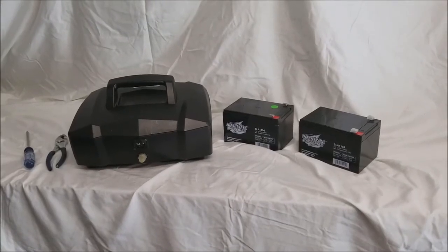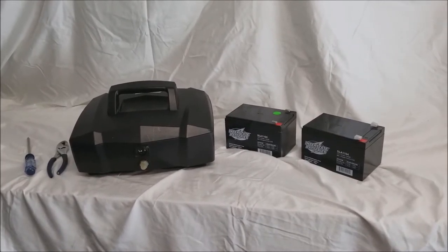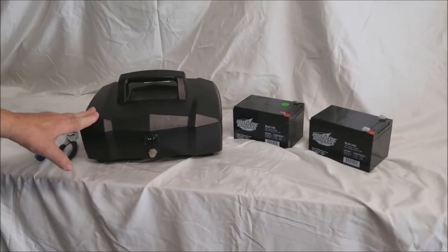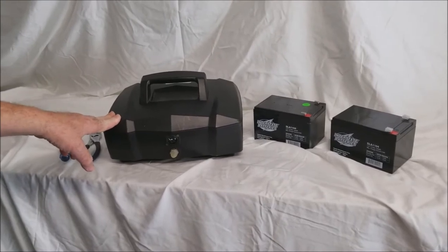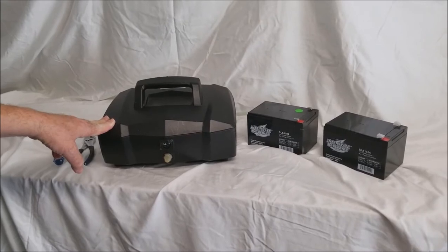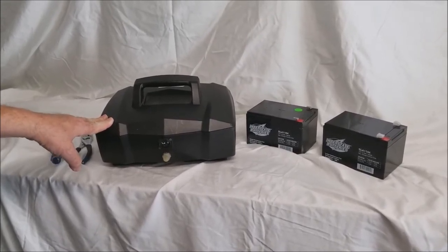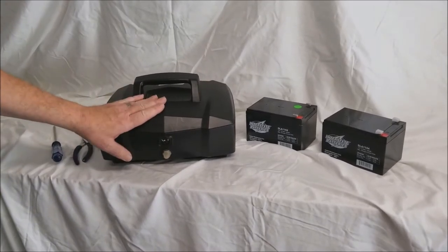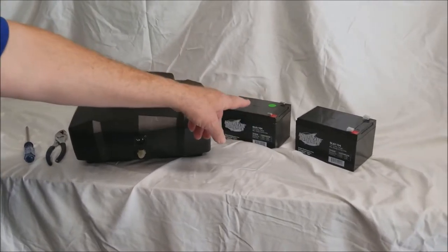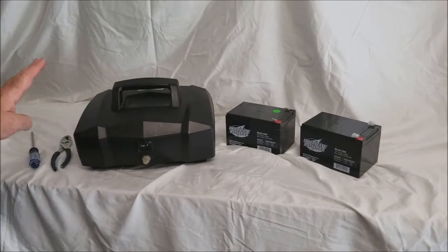I'm going to show you how to replace the batteries in your scooter battery pack. So what we have here on the table is a scooter battery pack. This one happens to be from a Drive Medical Scout scooter, but the process is the same regardless of whether you have a Scout or a GoGo or something from Golden Technologies. You're dealing with a plastic box inside of which are two batteries that look like those. They may be a slightly different size or configuration, but the process is basically the same.